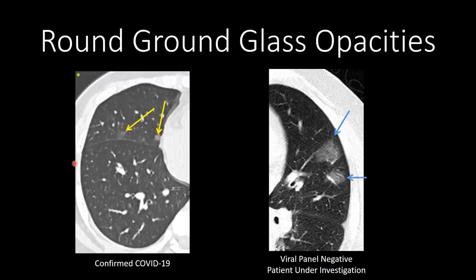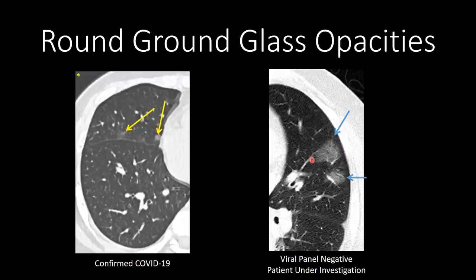Here we have a case from Adam Bernheim at Mount Sinai showing early ground glass opacities — small, ill-defined ground glass opacities with a rounded configuration. This is a patient presenting with fever and respiratory symptoms who had a negative flu and traditional viral panel PCR, and is therefore under investigation for COVID-19 infection. We can see these ill-defined ground glass opacities with a rounded morphology in the periphery of the left upper lobe.